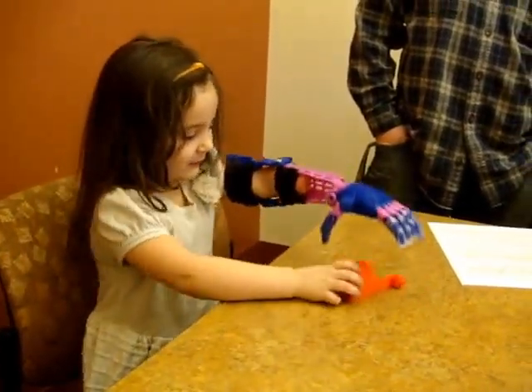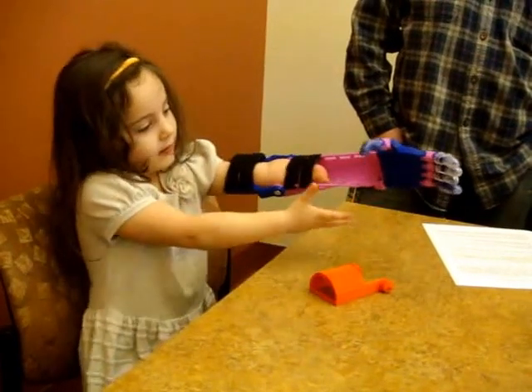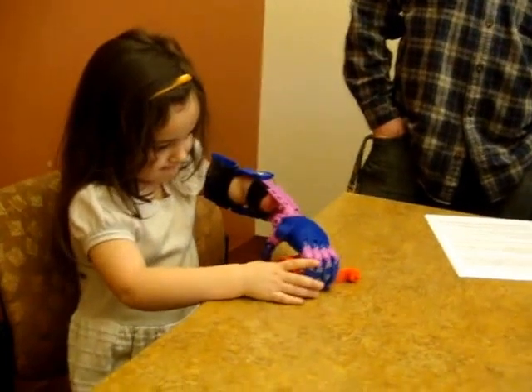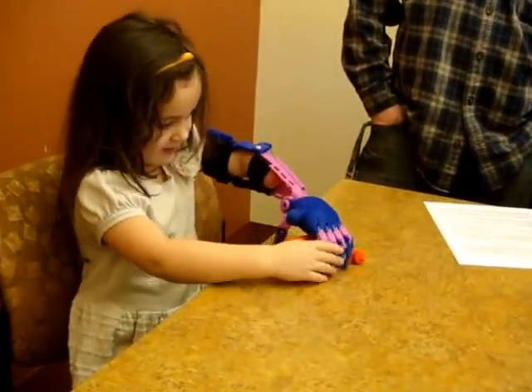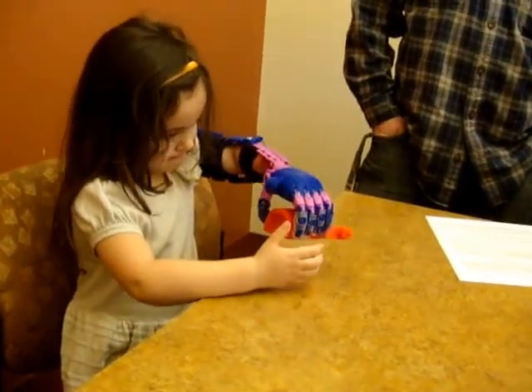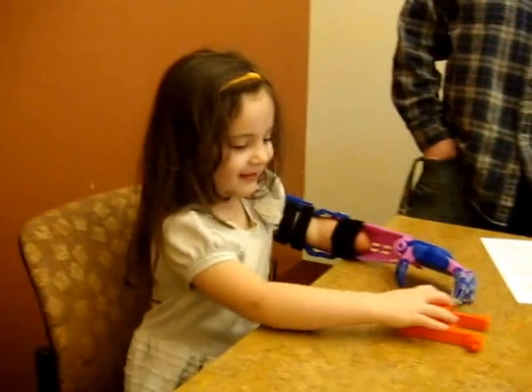If you can do it like that, I would be really impressed. That might be worth an ice cream cone. We can show the colors up — do it. And just bend really tight. Excellent. Great job.